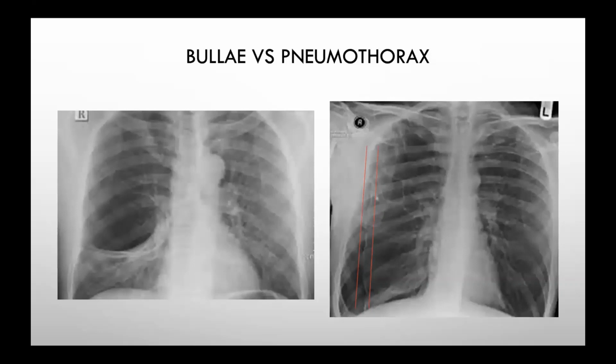If you can't see that rim and your patient looks mysteriously well for someone who you think has a pneumothorax, chances are they don't have a pneumothorax and they've just got bad bullous emphysema and they're breathless for some other reason. So it's worth getting a formal radiology report if you're not sure, or asking a senior for help. Failing that, if no one's sure, then no radiologist in the world would turn down a CT if they can't be certain of a pneumothorax on X-ray.